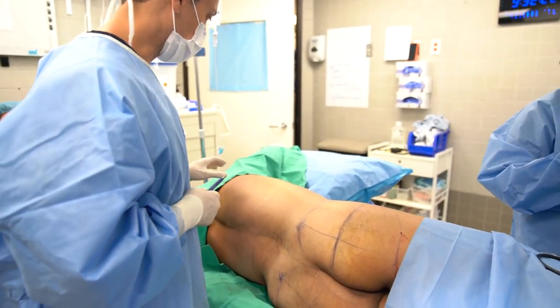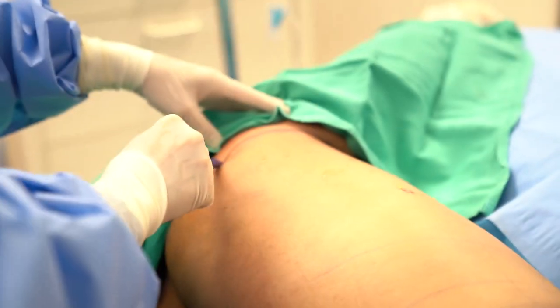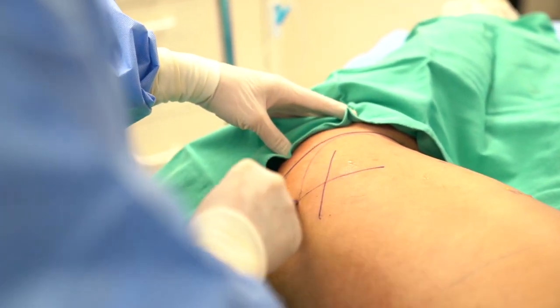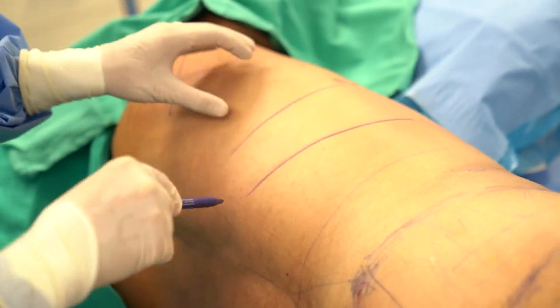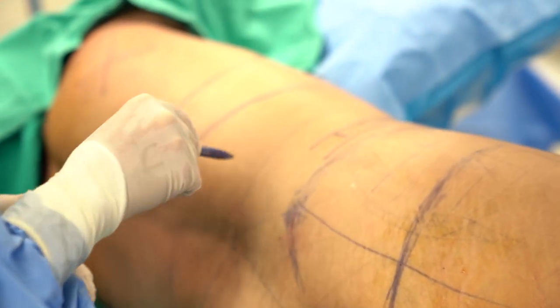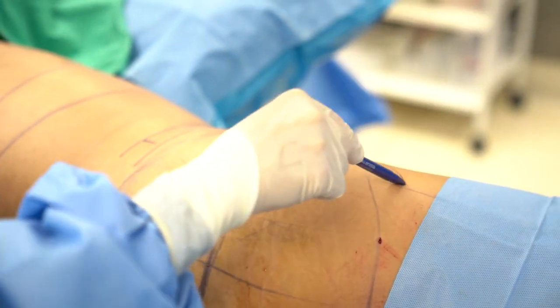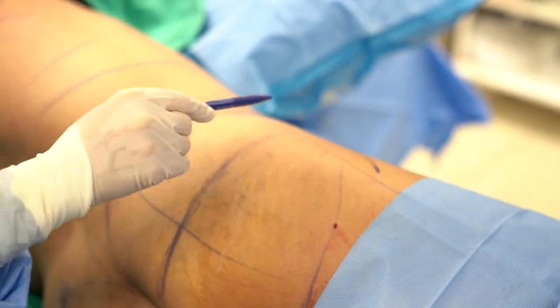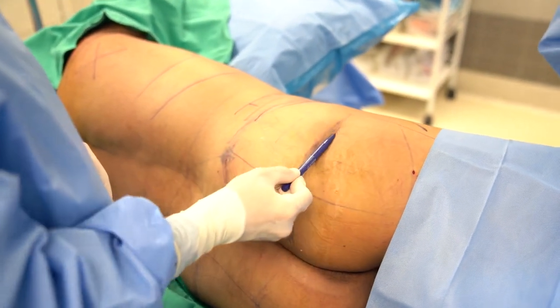Let me show you the before. This is before the 360 lipo. I come up very high — this is the armpit, this is the back — so I'm going to get all the fat out of her upper back, mid back, this is the flank or waist, and this is the hip roll — I'll mark an H for hip roll. When I transfer fat I'm going to build up the outer portion of her buttock for a rounder shape and build up her outer thigh here.